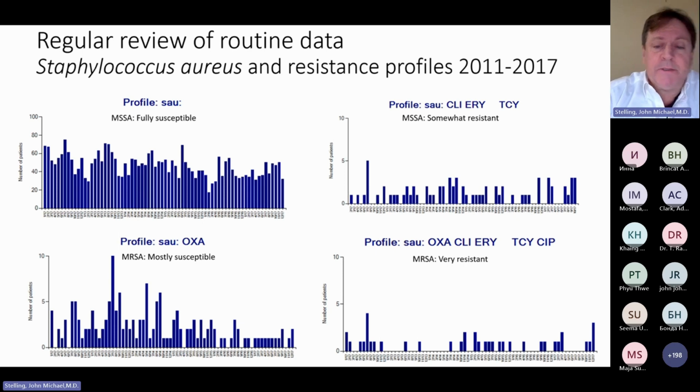Were these hospital infections? In the lower right, you also see MRSA, but these are multi-drug resistant MRSA, resistant or intermediate to 5 drugs. And here there's not an obvious outbreak, except at the beginning, there is a month with 4 people in the same month. In the most recent time period, there are 3 people in the same month.